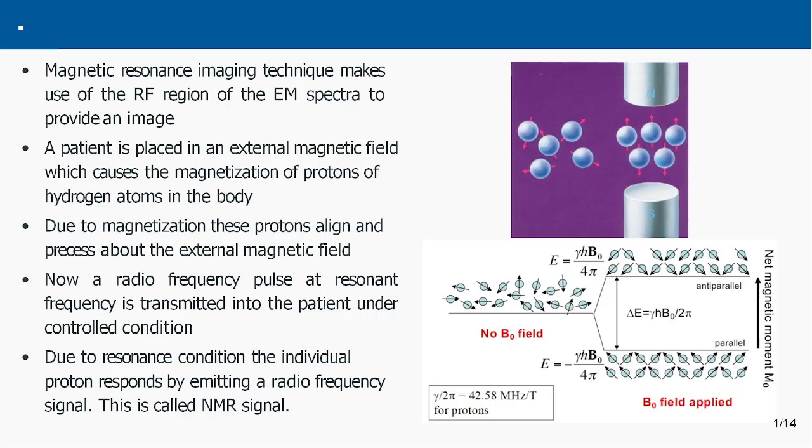and we know that it has no neutron inside its nucleus, and this proton is revolving or spinning, as we previously know, with a spin of plus half and minus half. Due to this spinning of protons, it is just like a current in a circular path, which will create a magnetic field or magnetic dipole.